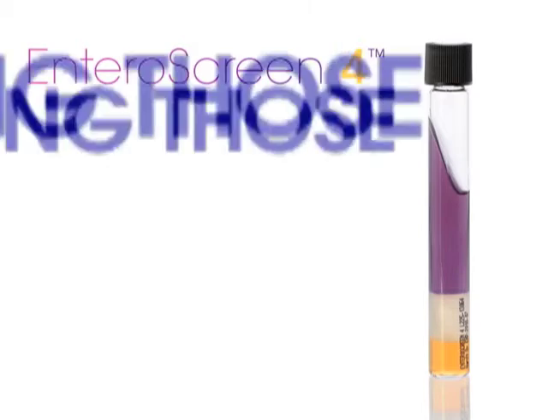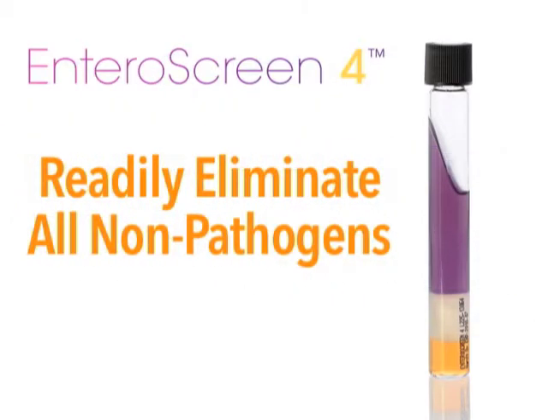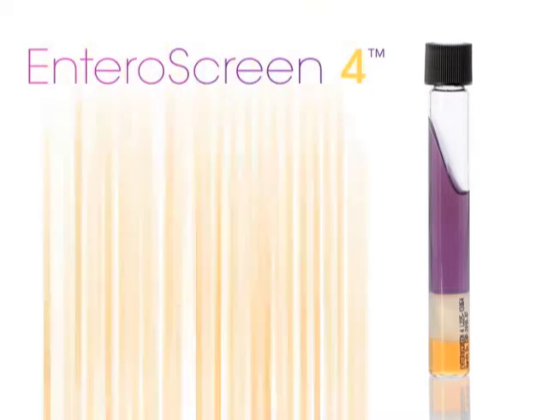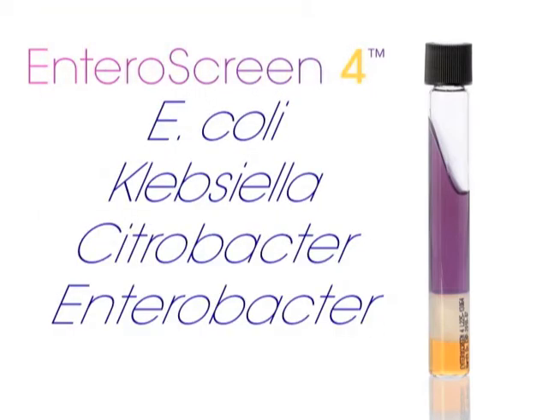Using those four color reactions, you can readily eliminate all of the non-pathogens, such as Proteus, Morganella, Providencia, and the less common lactose-negative E. coli, Klebsiella, Citrobacter, Enterobacter, Serratia, and others.